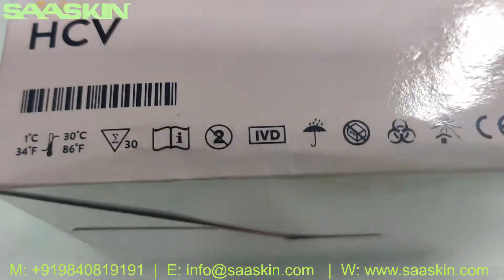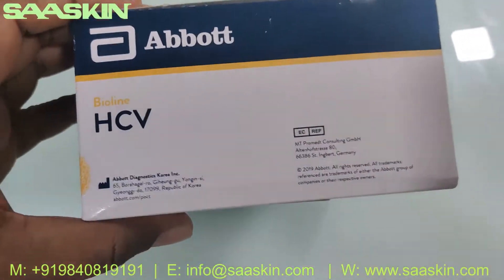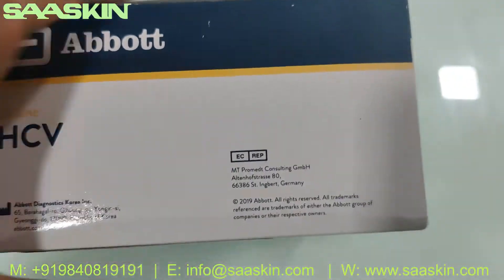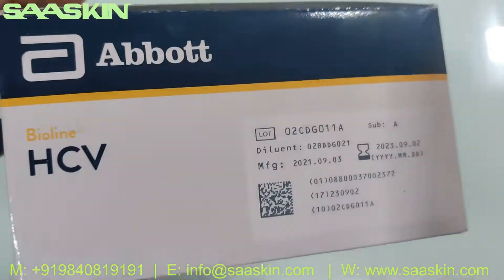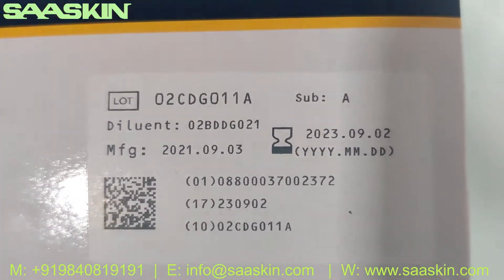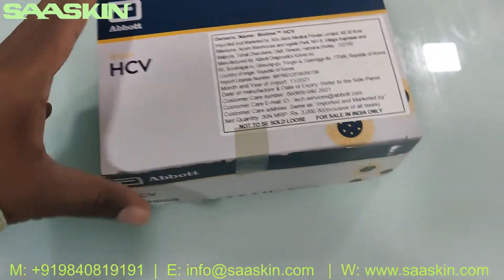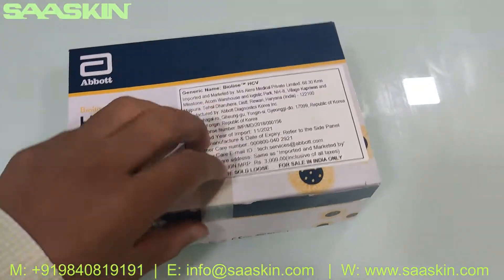I'll just go around the box. You can see this is manufactured in Korea, this is how it looks, and on the standard you can see you have two years of validity. So let me unbox this for you.